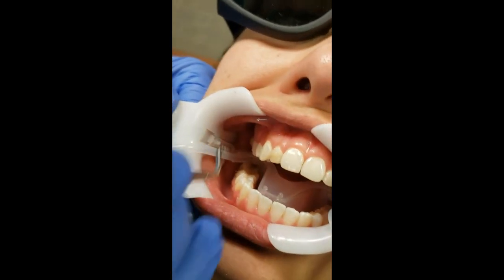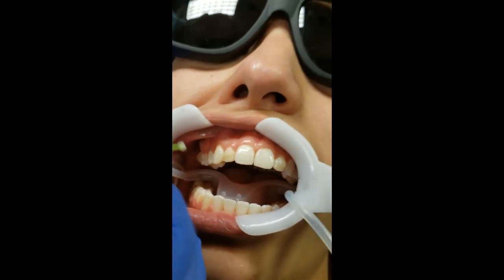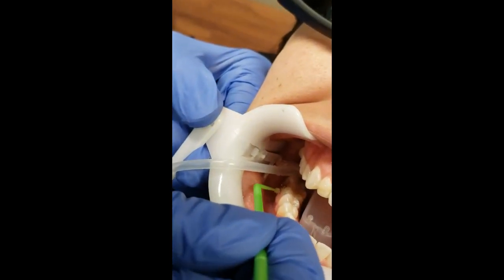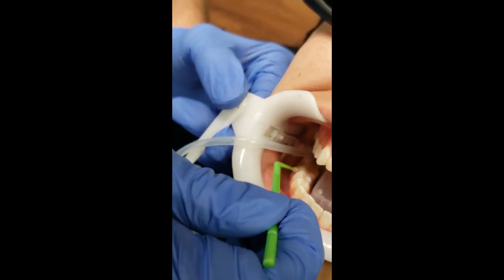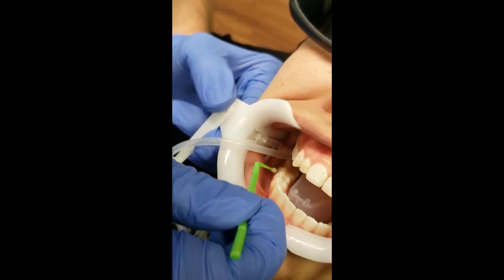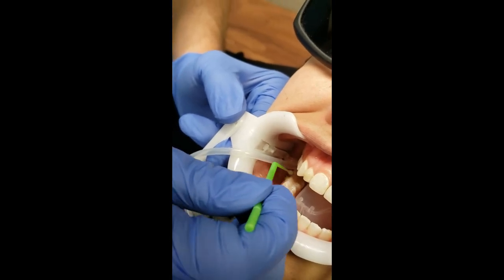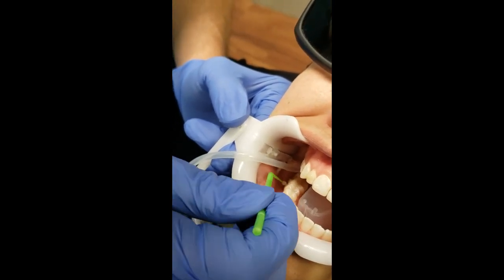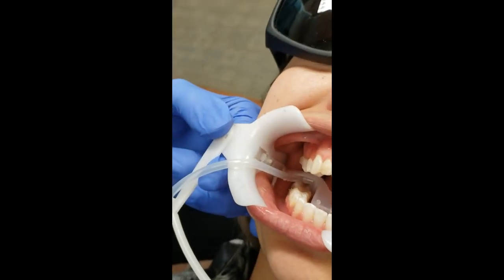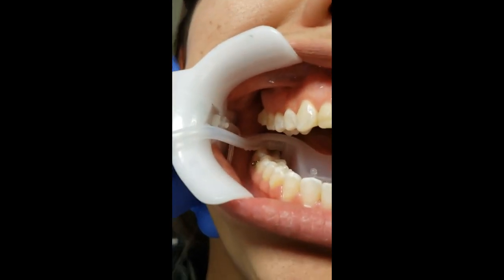So it doesn't slip off and she can use that elastic. It's close to the gingiva, and then I'll take some micro brush and just fold this extra adhesive over the top for a little bit of added retention. This is one where I don't clean off the excess - I like to use that excess to go over the bracket pad, because it's not like a super great fit the way these brackets are designed.